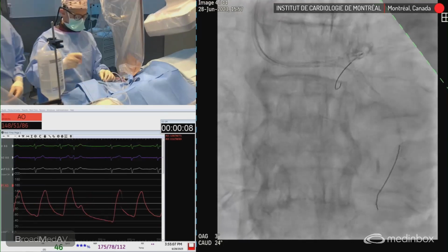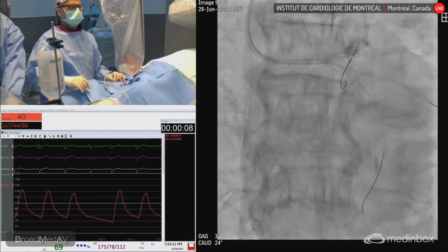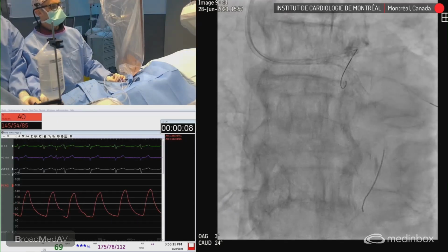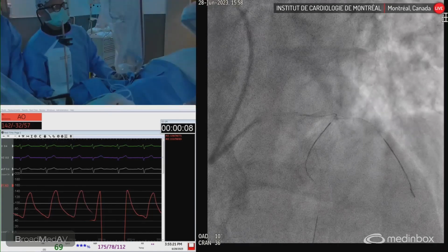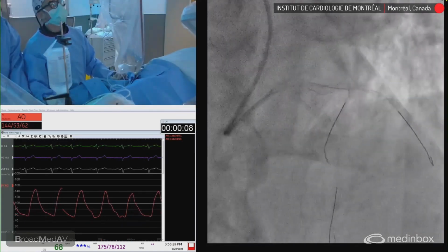I'm preparing the balloon to pot. Tu peux faire ça. Ok, c'est bon. Moins de tête. On voit trop la tête du patient. Vas-y. Comme ça, ouais.